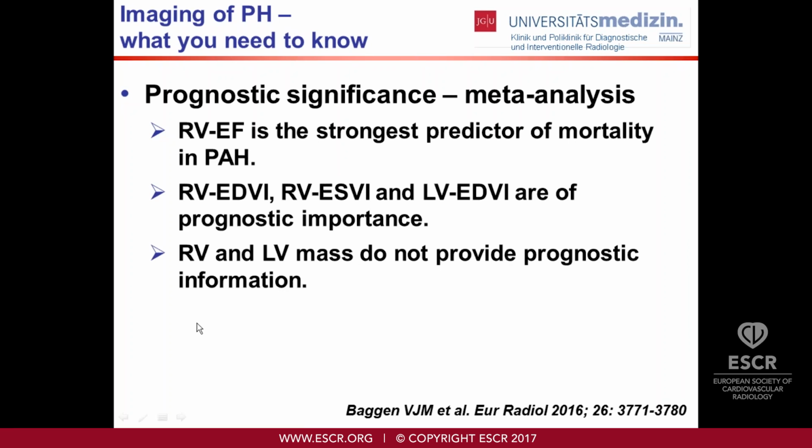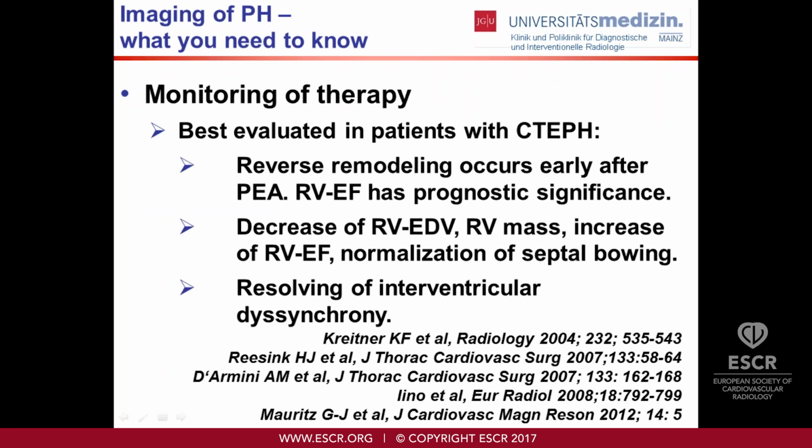And it's very interesting to see that within 2 weeks after a successful operation, you can see reverse remodeling, and also what holds true is a tremendous improvement of the right ventricular ejection fraction, which also has a prognostic significance. You can see a decrease of the right ventricle.